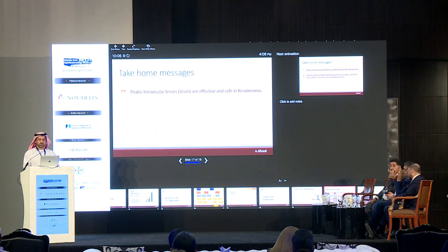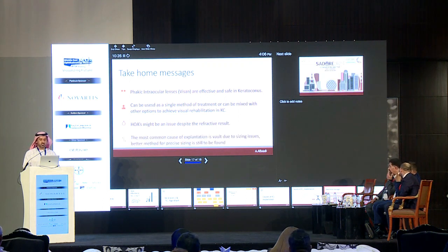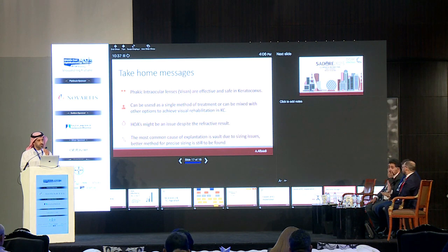So the take-home messages: phakic IOLs are effective and safe in keratoconus, and can be used as a single method of treatment or mixed with other options to achieve visual rehabilitation in keratoconus. Higher-order aberrations might be an issue despite the refractive result. The most common cause of explantation is the vault, due to sizing issues. A better method for precise sizing is still to be found. Thank you very much, and I'm ready to answer any question.